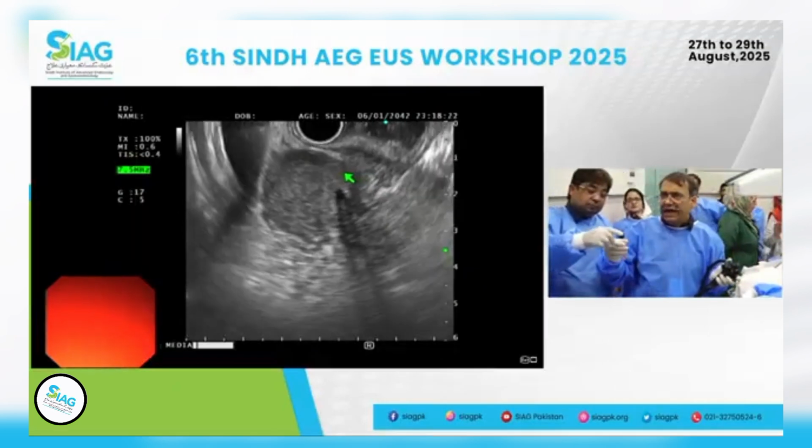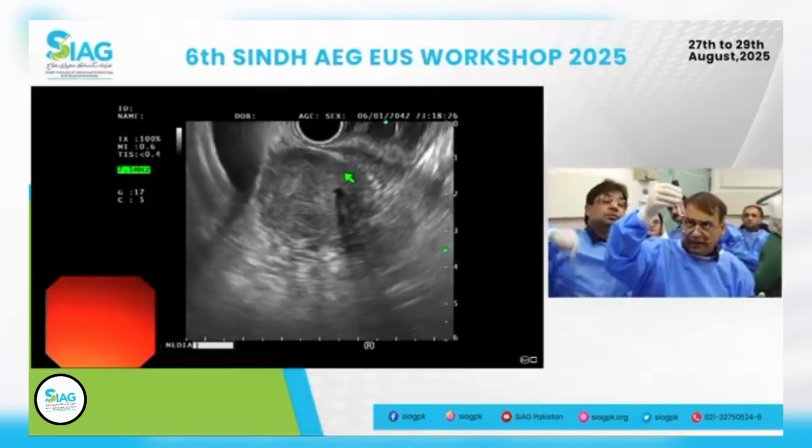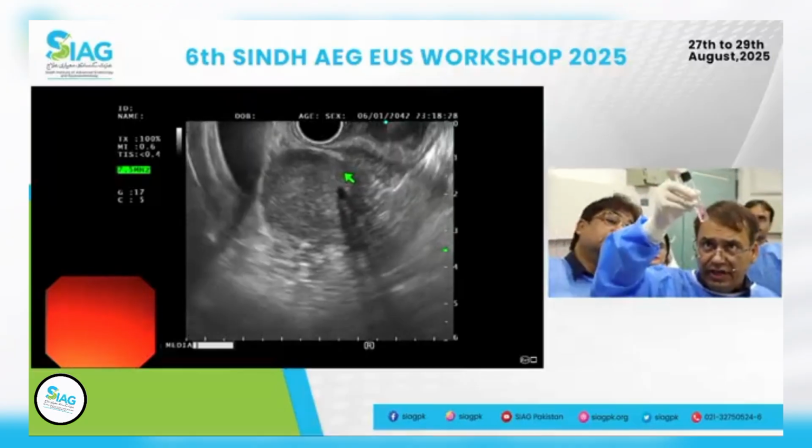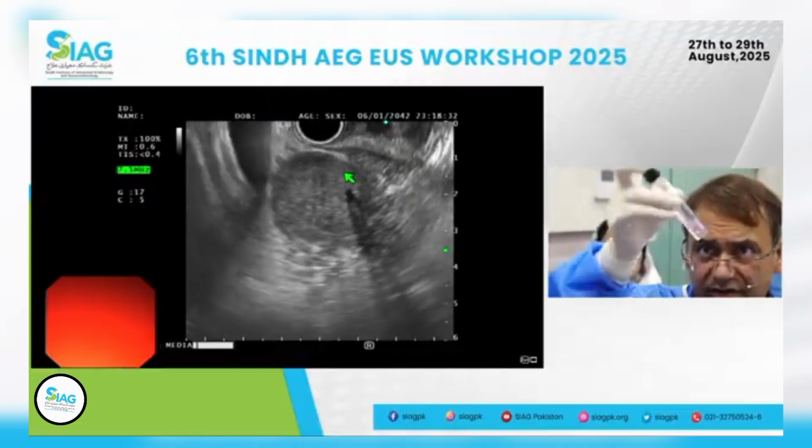So finally, I think he's quite happy with this one now. It's quite a bit of tissue there. You see the white? Wasim, can you take it to the other room?